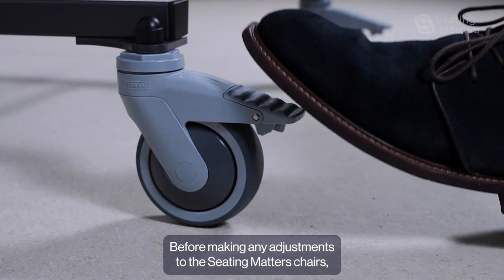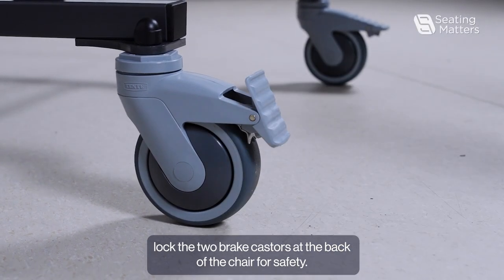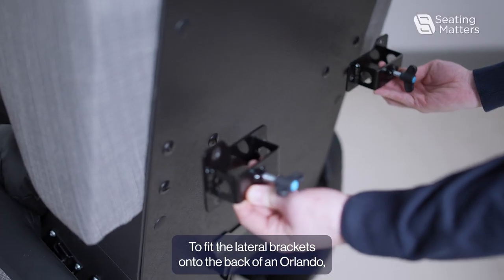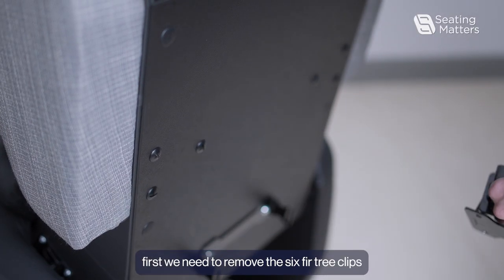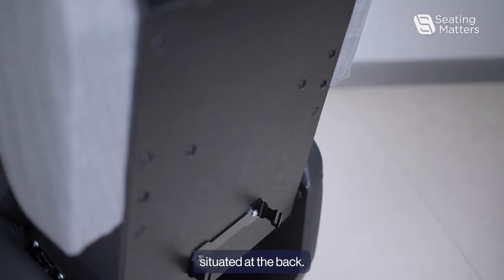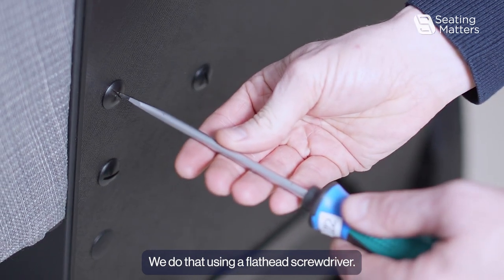Before making any adjustments to the Seating Matters chairs, lock the two brake casters at the back of the chair for safety. To fit the lateral brackets onto the back of an Orlando, first we need to remove the six fir tree clips situated at the back. We do that using a flathead screwdriver.